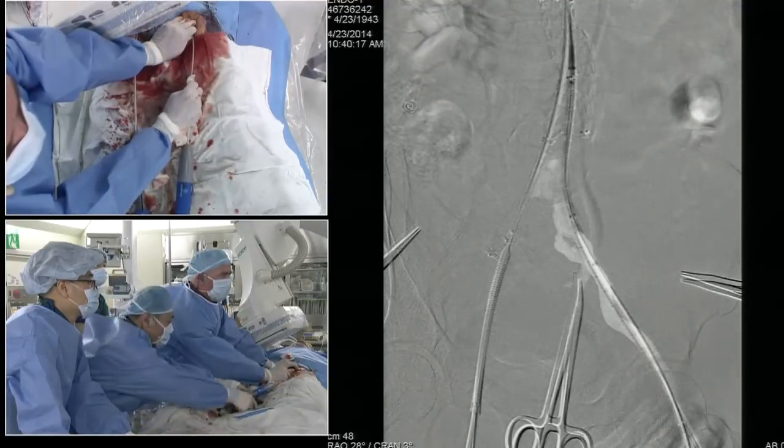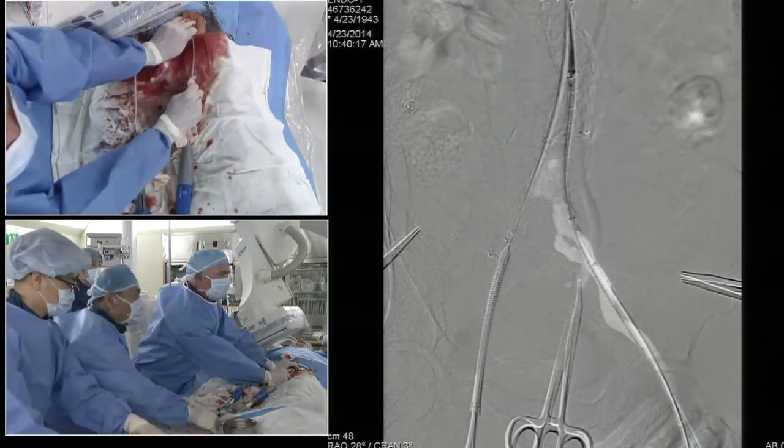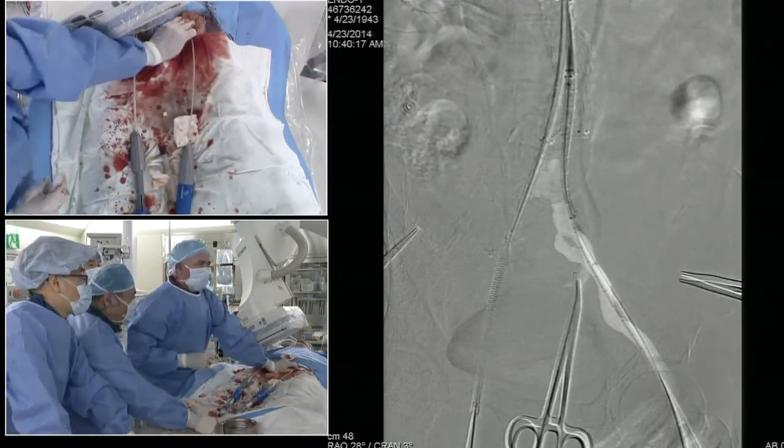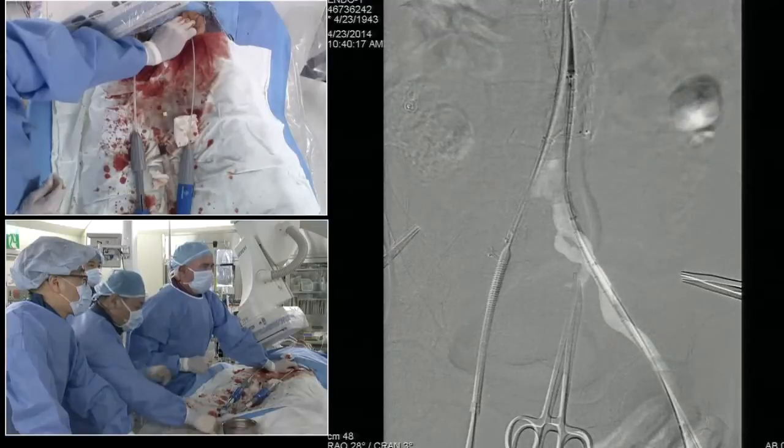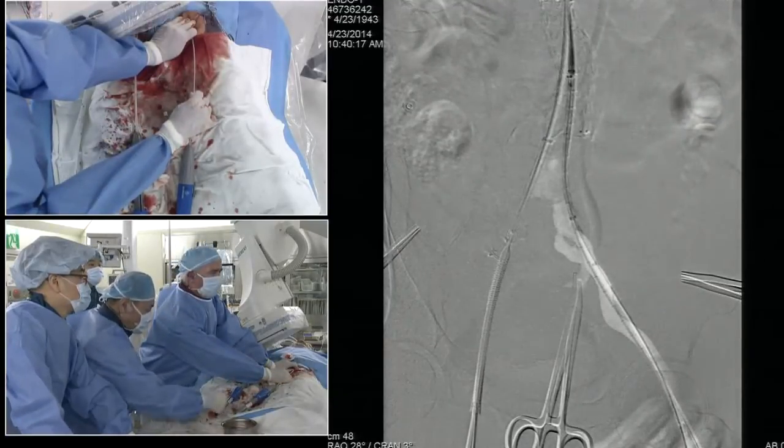Well, that's going to be close. I'm going to probably cheat down just a little bit. We want to have at least 2.5 rings of overlap, which we have. I think we're actually in pretty good shape here. It looks good.